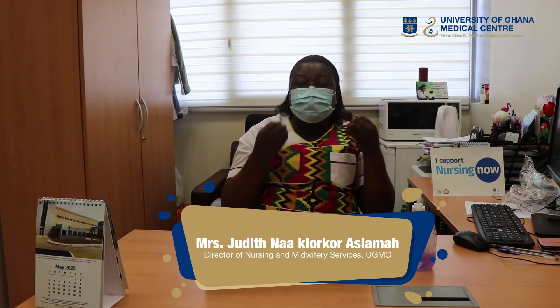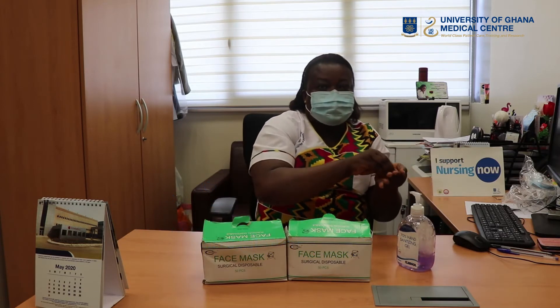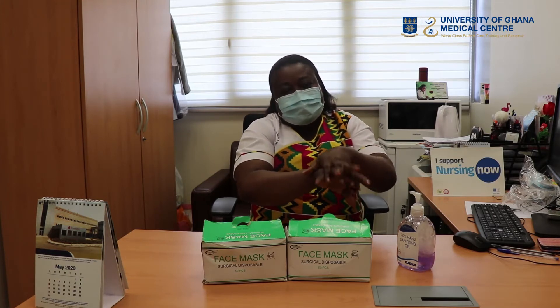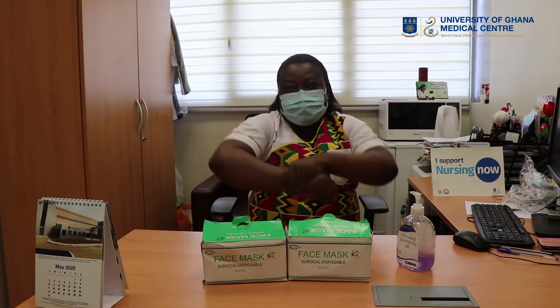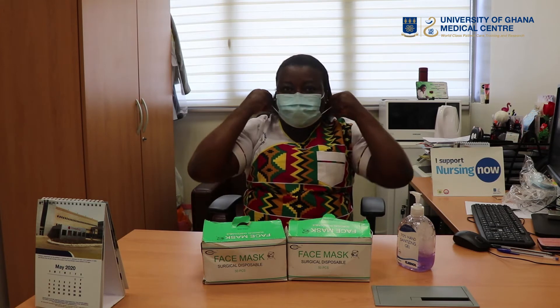I want to remove my loop face mask. I have to sanitize my hands again. So my fingertips, palm to palm, palm to dorsum. Then I will interlace, cap, turn to my thumbs, then the wrist. I'm now going to hold the two loops together like this.